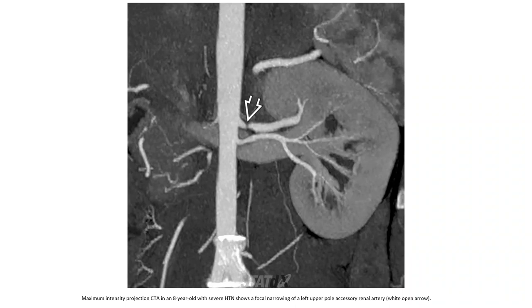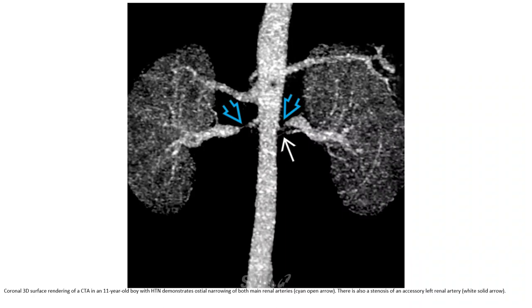Maximum intensity projection CTA in an 8-year-old with severe hypertension shows a focal narrowing of a left upper pole accessory renal artery. Coronal 3D surface rendering of a CTA in an 11-year-old boy with hypertension demonstrates ostial narrowing of both main renal arteries. There is also a stenosis of an accessory left renal artery.